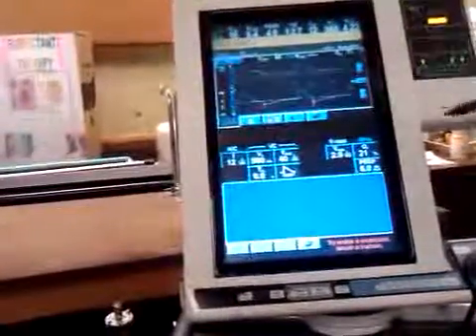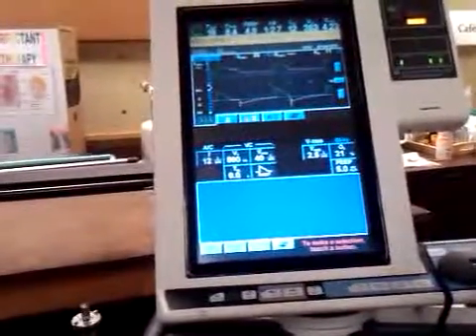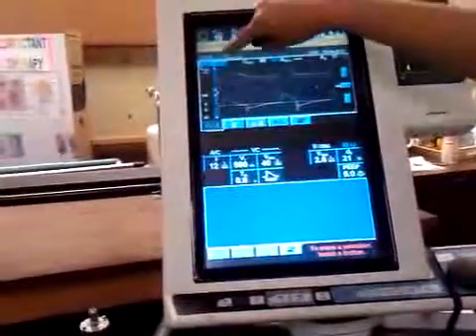To get your inspiratory pause for your AC mode, to get your P1 and your P2, I mean. What else do we need to do? Oh, and don't forget to unfreeze so you can see the other wave.